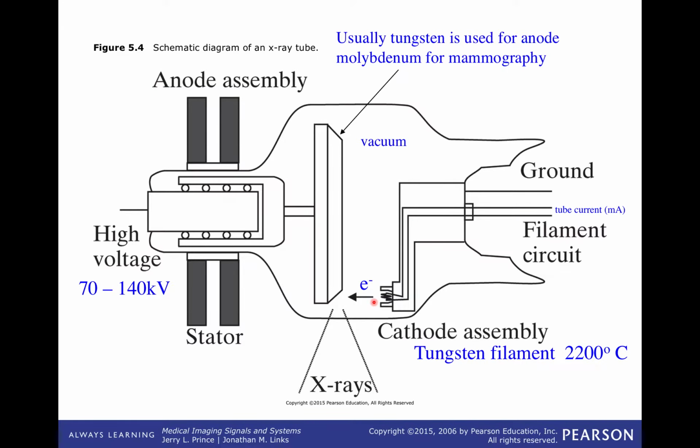Here's the basic diagram of that system. Cathode here, spinning anode in the vacuum. We're going to put current through the cathode at a given milliamp, and we're going to set that anywhere from 50 to 1500 milliamps, which is where X-ray tubes operate now.